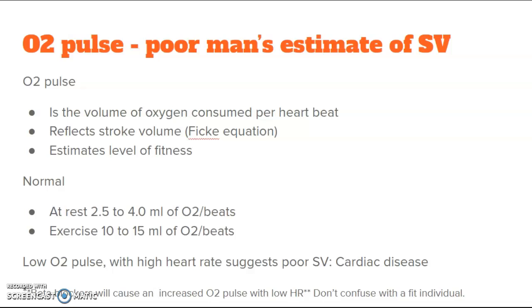I mentioned before, if a patient reaches their max heart rate, it can be a measure of the patient's effort, which, if they are giving good effort and everything is linearly increasing with VO2 max, can also suggest they have a good fitness level. So O2 pulse is another thing to look at to determine a patient's fitness level. Let's take a look at it.